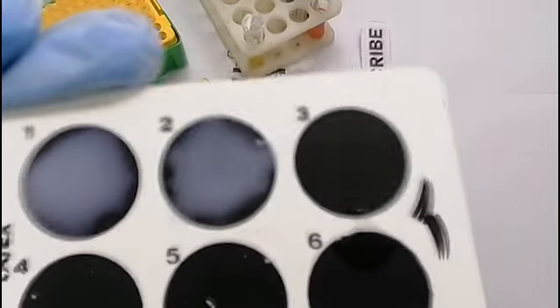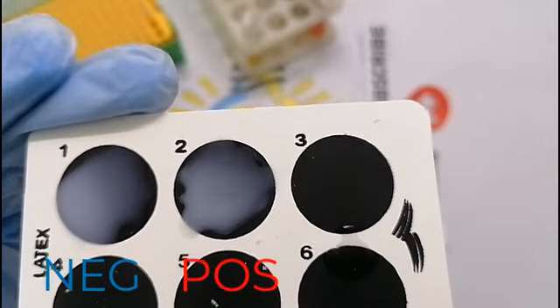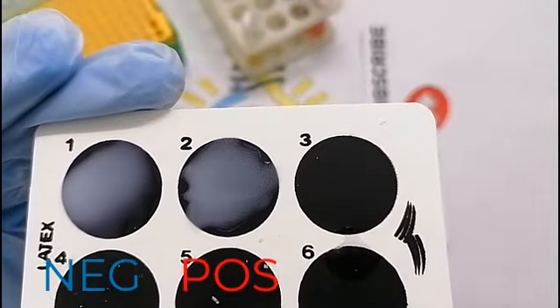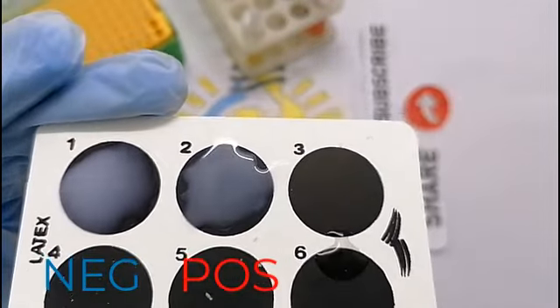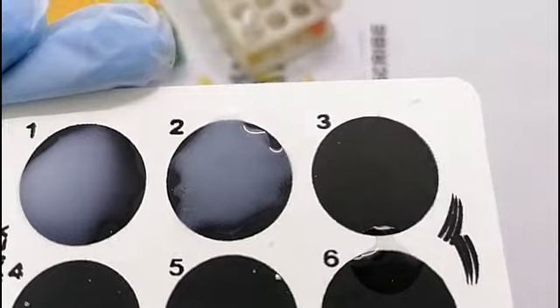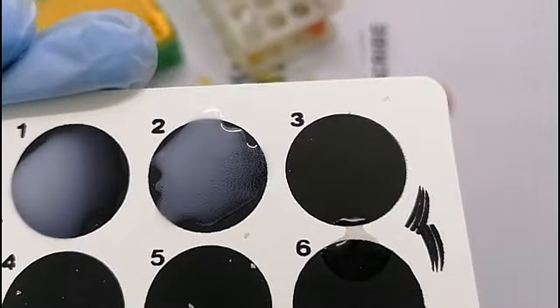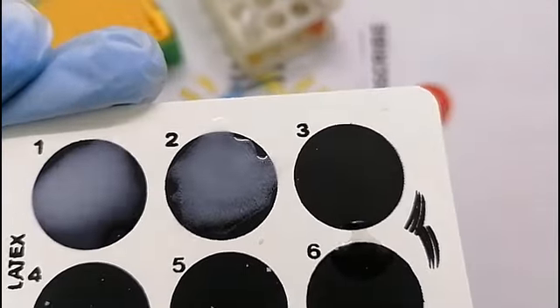In the first circle, when I place the negative control, no agglutination is observed. However, in the second circle, when I place the positive control, a 3+ agglutination is clearly observed. This indicates that our kit is functioning properly.